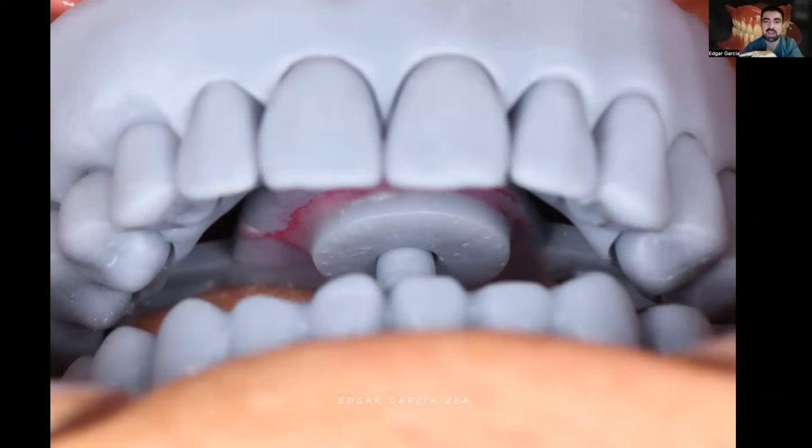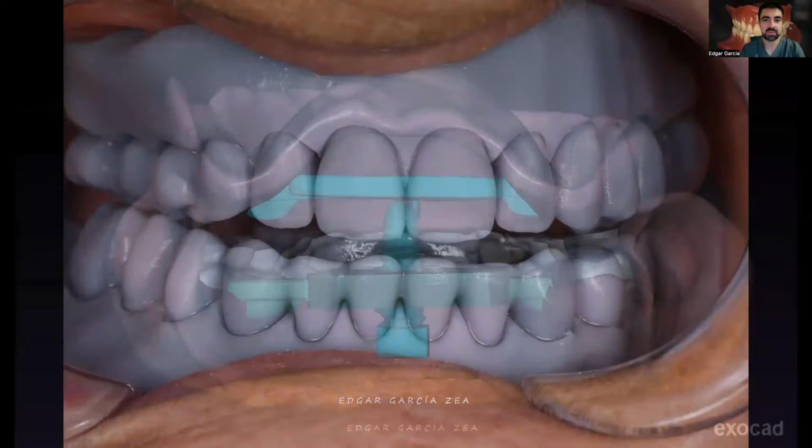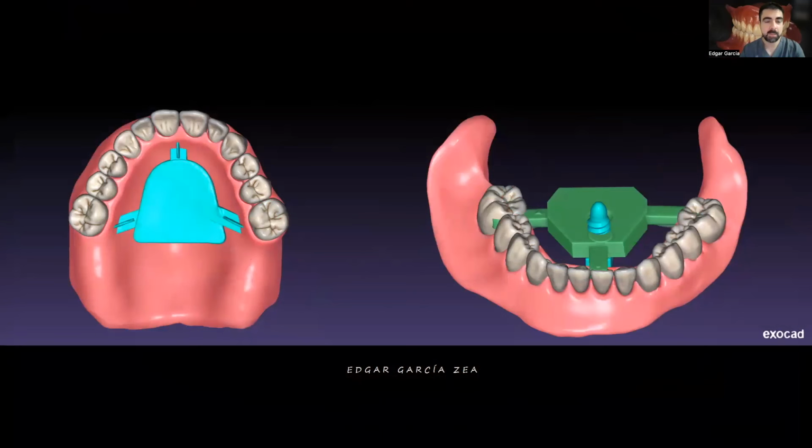Quick question, Dr. Garcia, because I know that when you're doing Gothic arch tracing, you don't have the little circle initially placed. Normally, when we were using the metal Gothic arches, we had to put black paint on the flat portion of the upper. Then you had the patient move left and right, forward, until he went all the way back. And once you got that V point, that's when you inserted that little circle so that you can lock that in place and get your bite registration in that area. Do you use the same technique with this printed Gothic arch? Exactly the same technique.